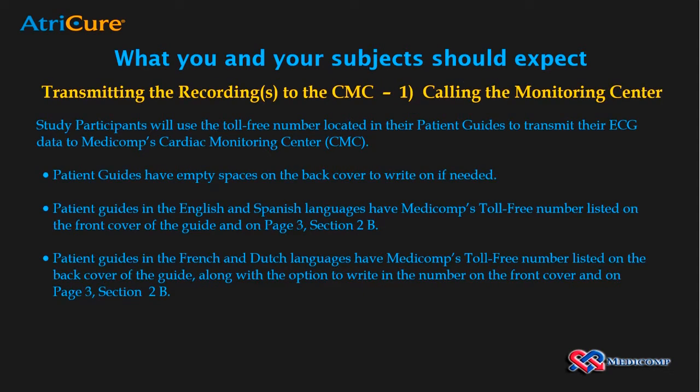Although we will get into the hands-on later, we wanted to take this time to describe to you exactly what will happen when the patients call into our monitoring center to transmit their recordings. They'll find the toll-free number in their patient guides. The numbers are in different places depending upon the language the guide is written in.